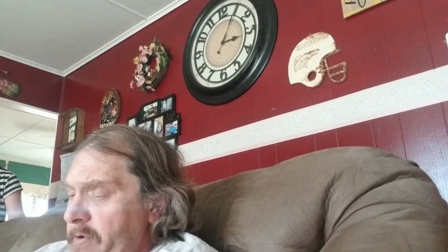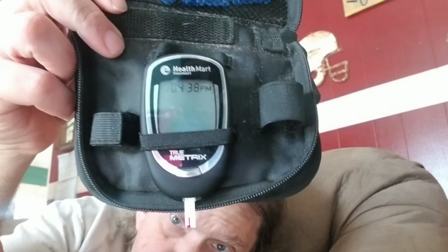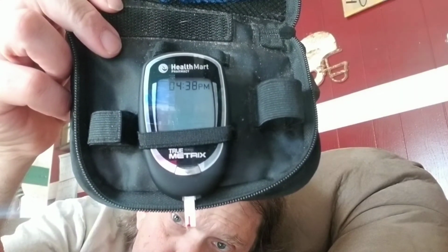Alright, it is 2 hours. Now, if my blood sugar has dropped still below 118, then my spike is already over with. So, we'll see. If this is under 108 or 118, I'm going to go ahead and call it good at 2 hours. Alright, big old drop of blood. 120, you know? It went up just a shade. So, 120 is absolutely normal. If that had been a pint of regular ice cream, I'd probably have a blood sugar of 300 by now. So, I'm going to call it good at that.